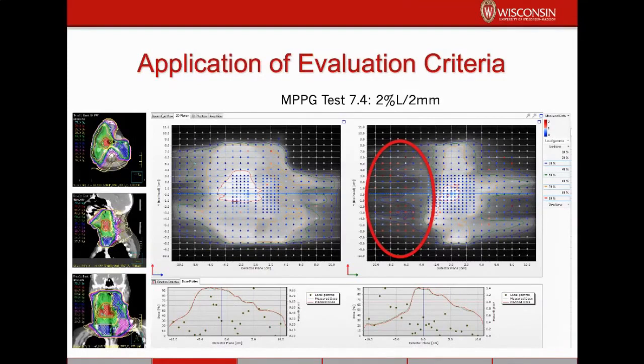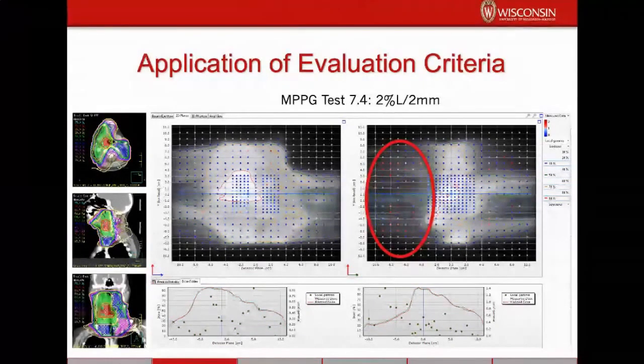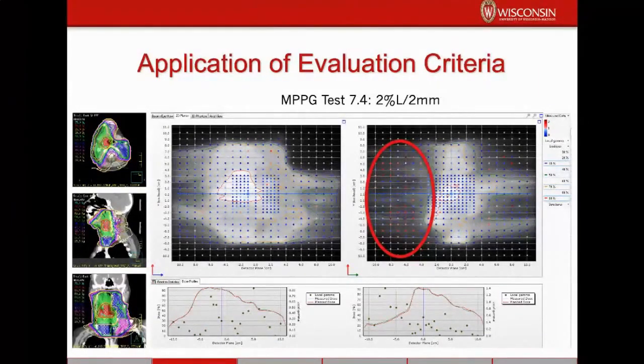And it will always be very difficult to implement in practice because it represents the best practices of everybody everywhere put together in one place. And really, no one institution is doing every single thing in a task group most of the time, especially one like task group 53, where if you really dig into it, you see there's tests on making sure that your digitally reconstructed radiographs have the right proportions and things like that.